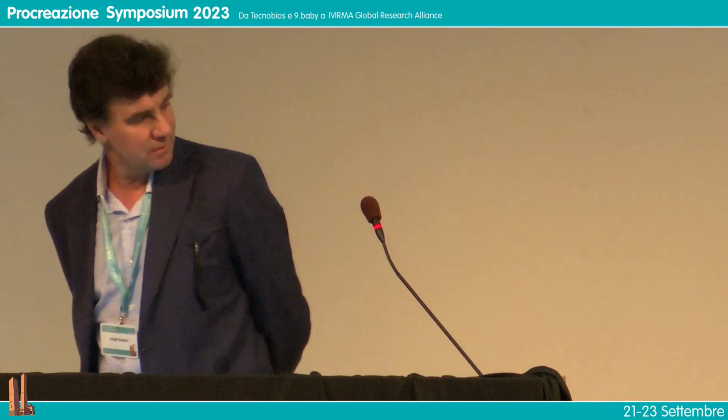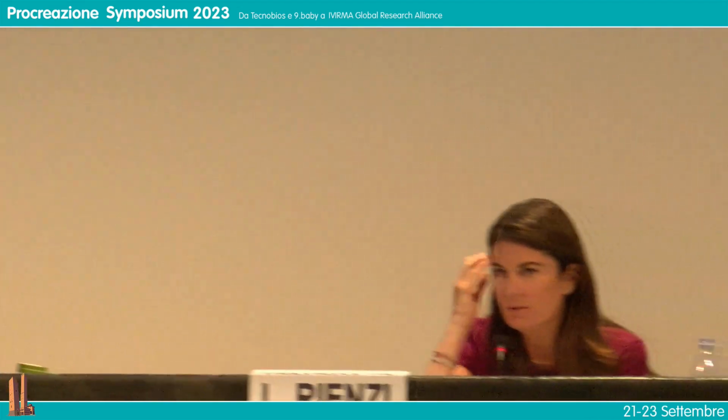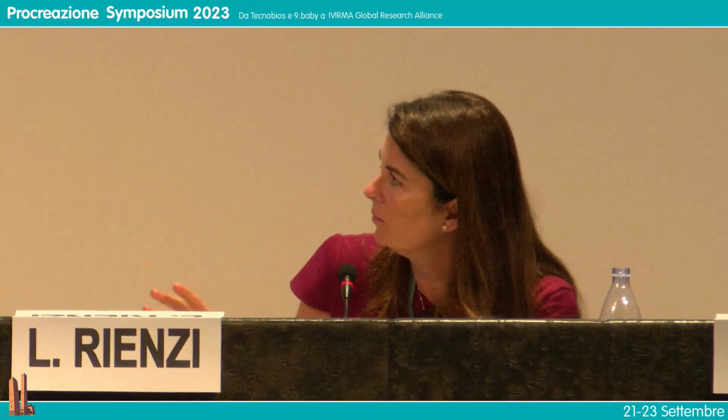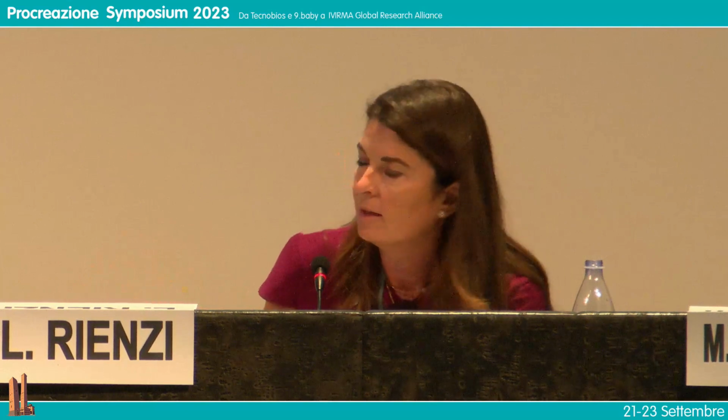Sorry. I have a question for Nikica in particular. I think many of us embryologists are very surprised that the undisturbed culture system, just from a cultural point of view, has not really improved our results when you look at time-lapse beside embryo selection.